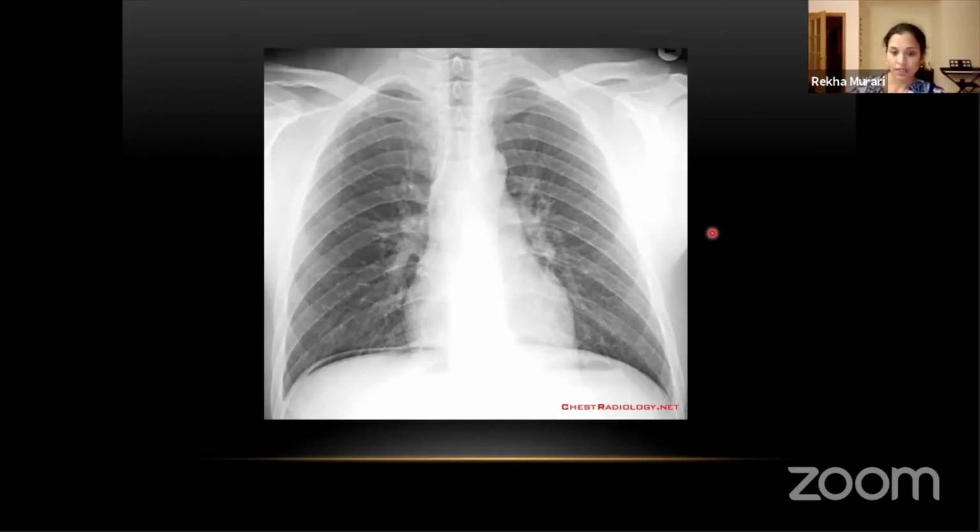So this one. Yes, most of you have said the right thing. Pneumoperitoneum, air under the right hemidiaphragm. Well done. I consider this X-ray a subtle finding, and it becomes more obvious when you do the review areas and go under the diaphragm. So it's important to do the review areas. Can you see that line?